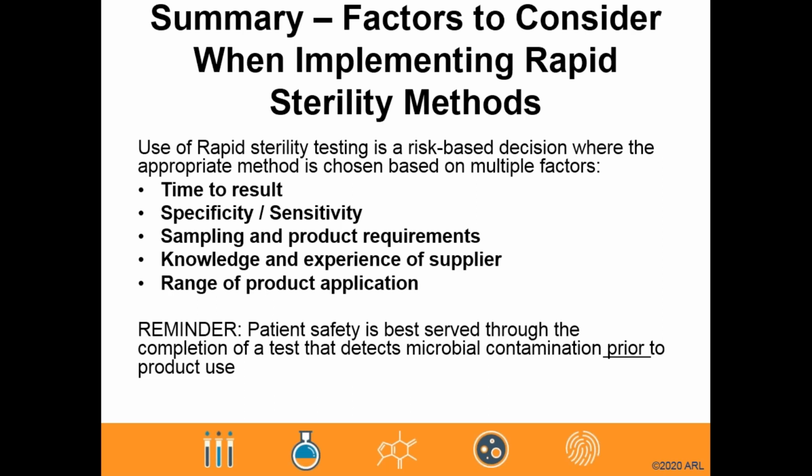The use of a rapid sterility test is a risk-based decision where the stakeholders must bear in mind that patient safety is paramount, that good manufacturing practices and superior quality system management must be maintained, irrespective of whether you change to a rapid sterility method or not.